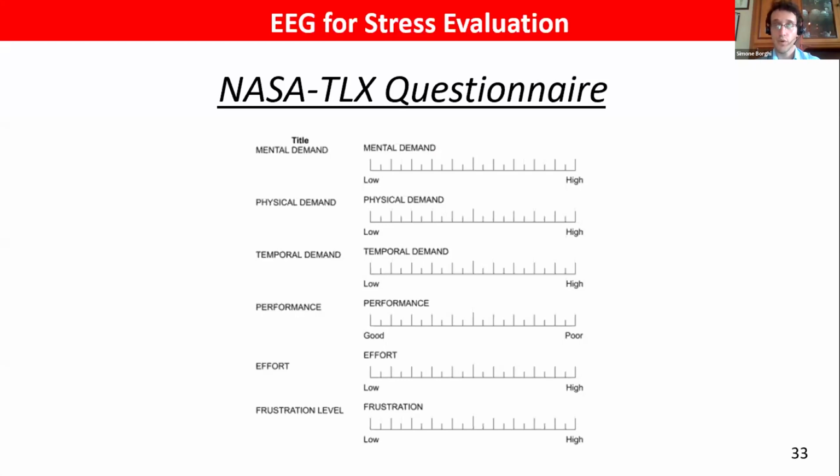Then we can create, for example, a binary classifier, stress or no stress, depending on the score. This approach was used to label a SenseCobot dataset in a simple binary classification. It can be adapted to create, for example, a multi-classification task with windows of score.